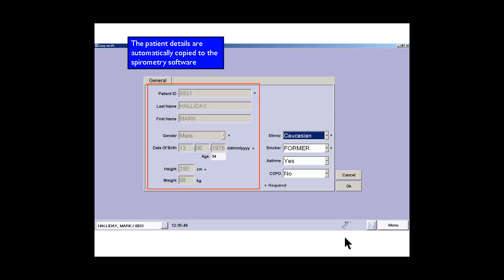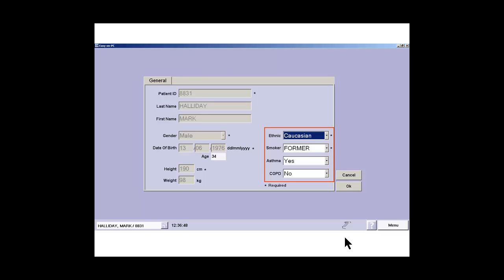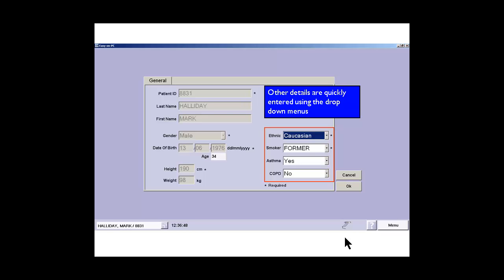We have some drop down boxes on the right hand side which we can select the appropriate ethnicity, whether the patient is a smoker, asthma or COPD. Once we're happy with this we can press the OK button.